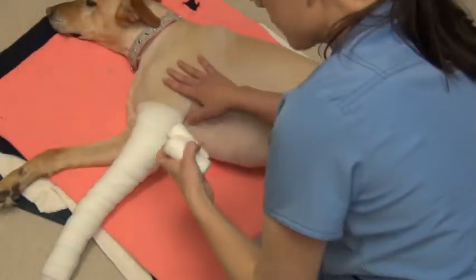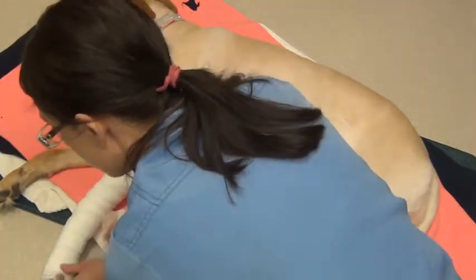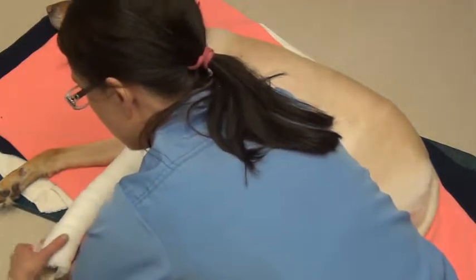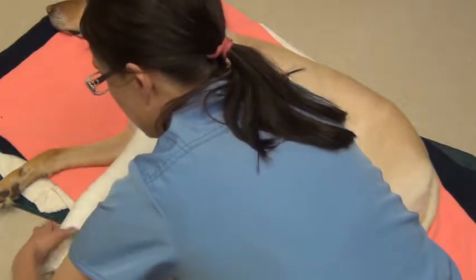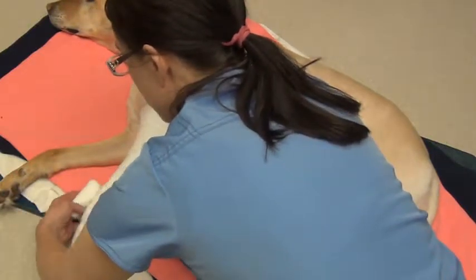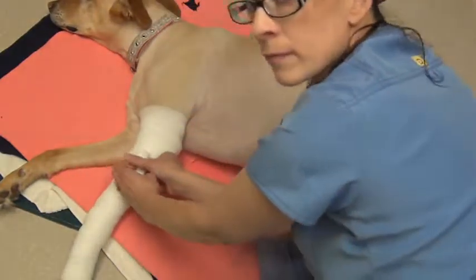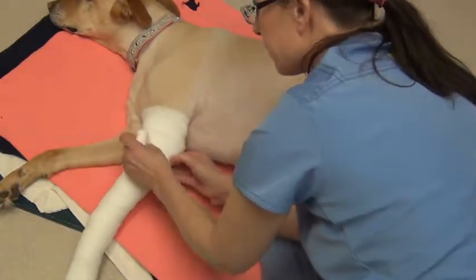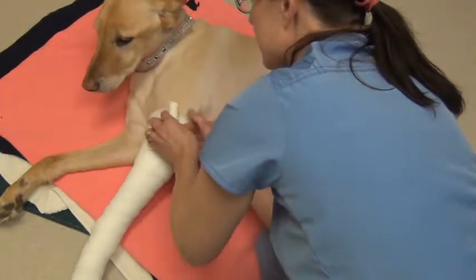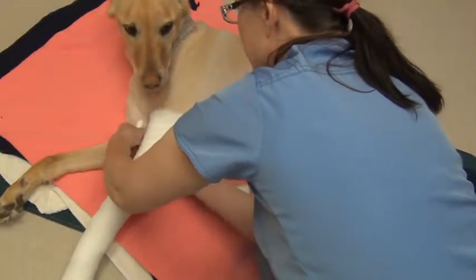Alright, sweet thing. Alright, so now time for us to go ahead and start using the roll gauze. We're going to follow the same pattern. Make sure my toes are out, and start this in the same fashion. I'm going to spiral over my cast padding and then lay that down onto the previous spiral about 50%. So I'm going to cover 50% of the previous spiral. She's being a very sweet girl. And this layer is kind of just to hold on all of the cast padding that we put on, so we don't have to be nearly as generous and cushy with this layer. I'm just going to give it the extra here.